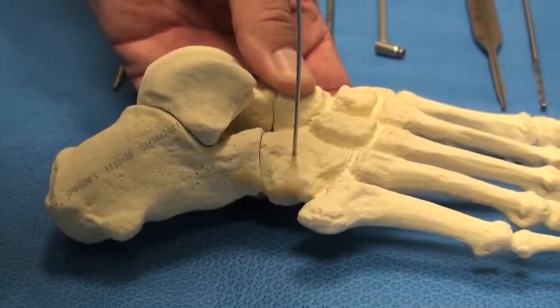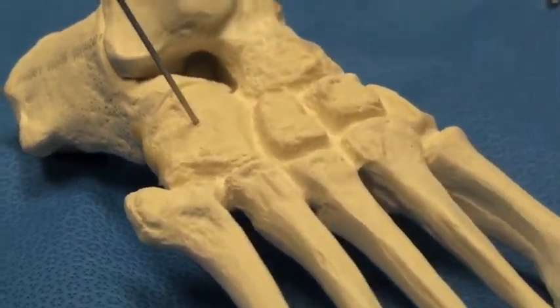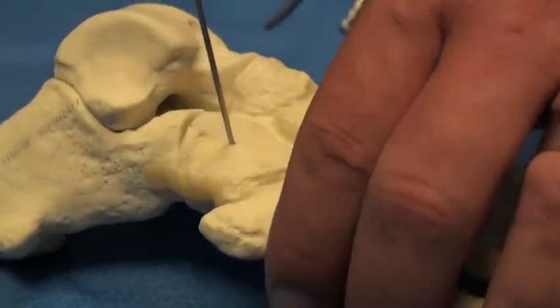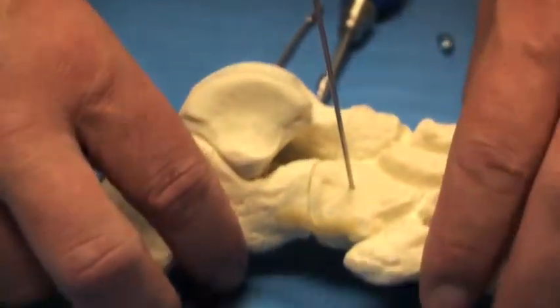Placement of the initial guide wire should be roughly 14 millimeters from the joint so that once the post is inserted, the post itself will be roughly a centimeter from the joint surface. Additionally, inserting the guide wire perpendicular to the curvature of the bone will help aid in inner frag screw insertion.